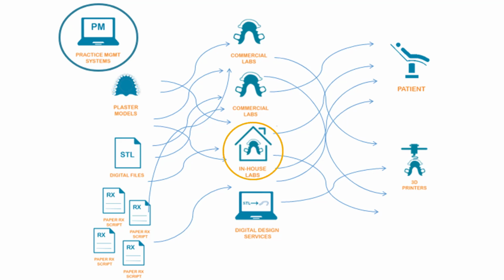And then you may have an in-house lab or send cases out to a digital design service. You have to coordinate and track all of that to get it back to the patient or to get it printed. And it's just confusing. Many times it's delegated to 1 or 2 staff who have to keep track of this, and you're probably spending more time and money on this than anyone realizes. It's just very inefficient and time-consuming.